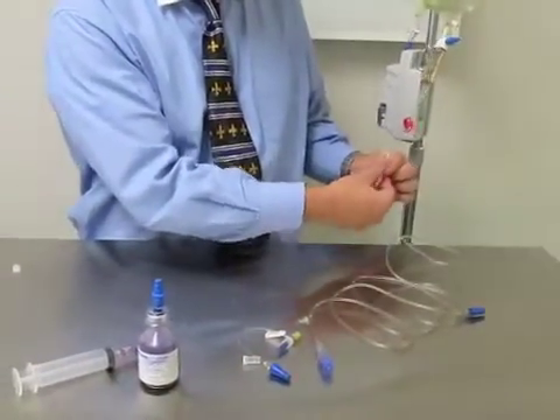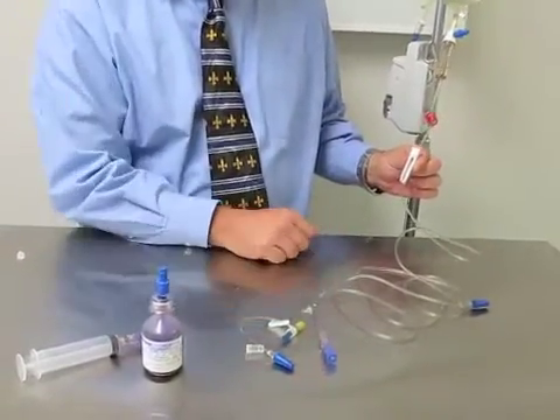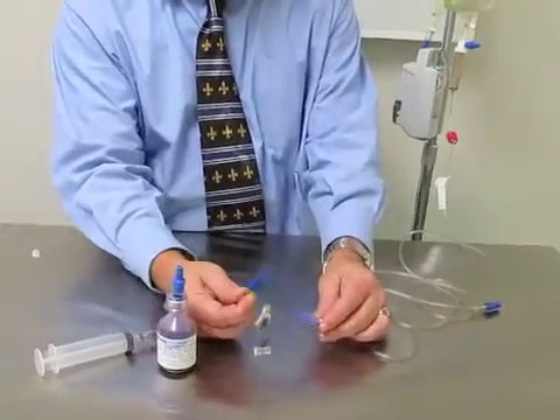As you'll see, I can open this roller clamp and the system remains closed until it has accessed a female lure such as a microclave.